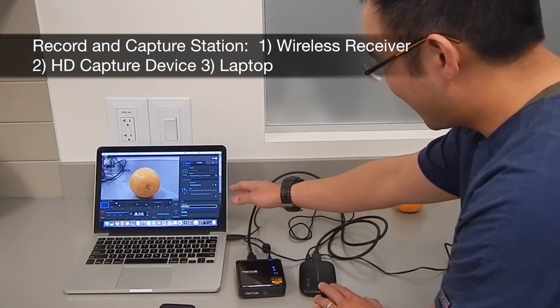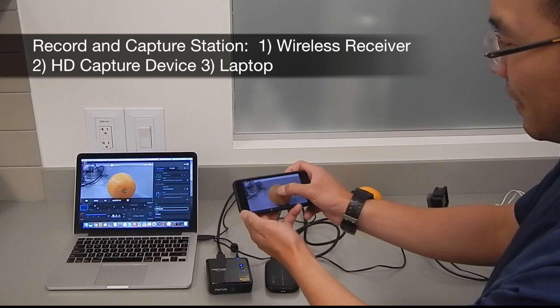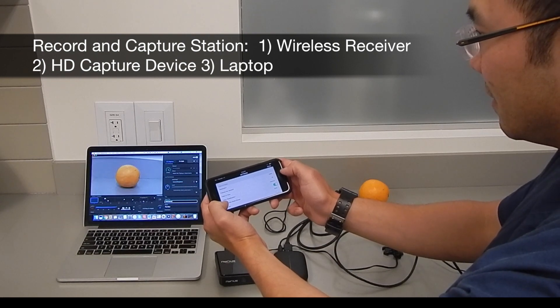Recording the video on a laptop allows for virtually unlimited storage. A mobile device can be used to start and stop recording, as well as make other adjustments, such as changing the field of view.